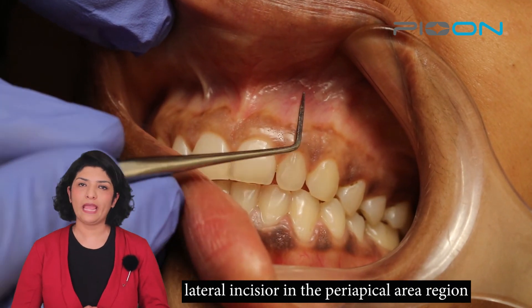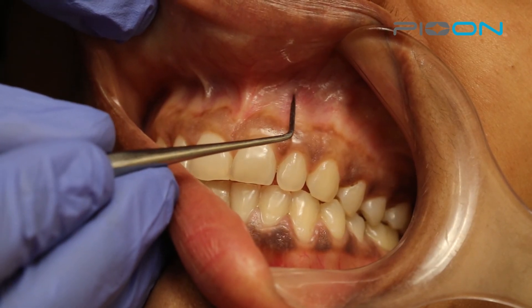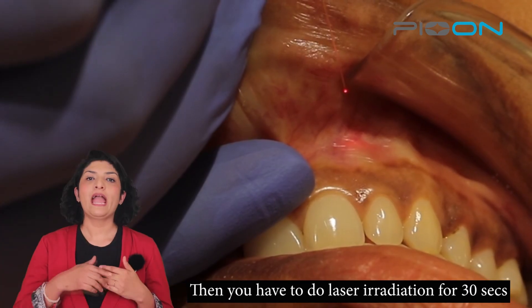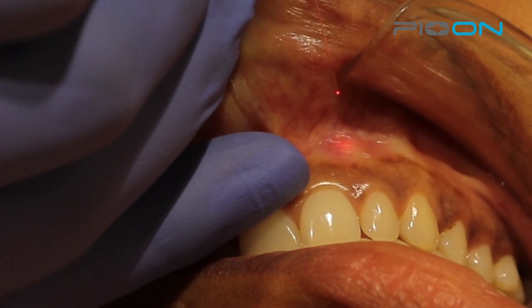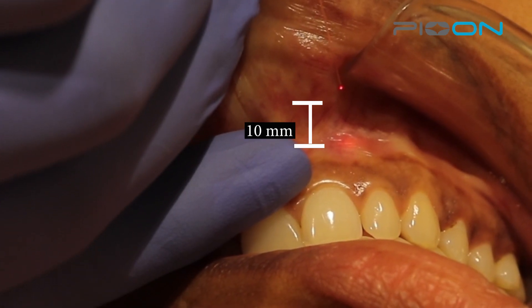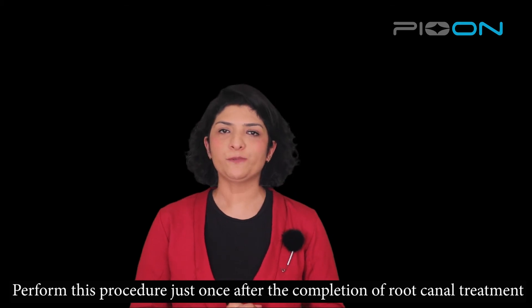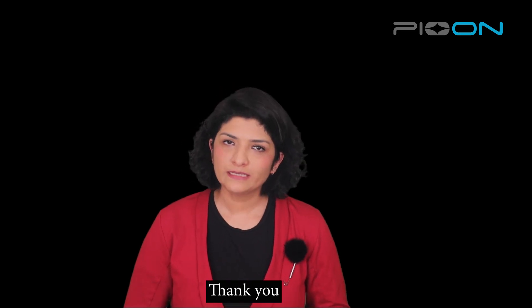You have to go around the periapical area for the lateral incisor, keeping the tip 10 millimeters away from the tissue around the apex, and then perform laser irradiation for 30 seconds. You will perform this procedure just once after the completion of root canal treatment.